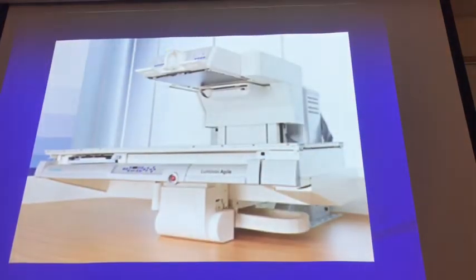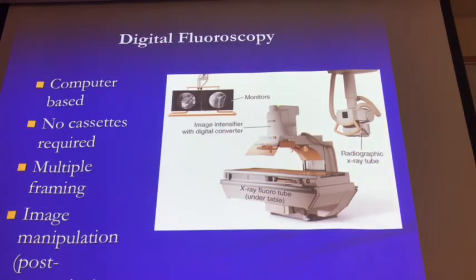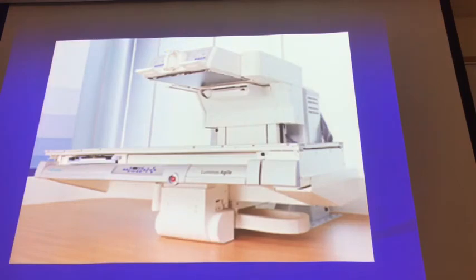Now, this is the most modern system. Here you have a flat detector. See, no image intensifier. This big hat here on the equipment, you don't have it here. This is a flat detector. It's a DR system, and so everything is done from the moment you acquire the images. They are digitized. So no special processes. With the other system, you still have to do a little processing before you send the signal to the computer. Here you don't have to.